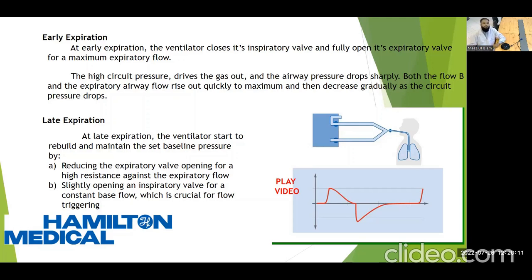In late expiration, the ventilator starts to rebuild and maintain the baseline pressure. So what is the baseline pressure? The baseline pressure is PEEP, maintained by reducing the expiratory valve opening for a high resistance against the expiratory flow, and slightly opening the inspiratory valve for a constant base flow, which is crucial for flow triggering.